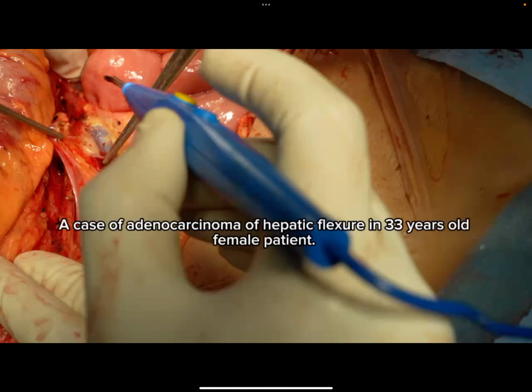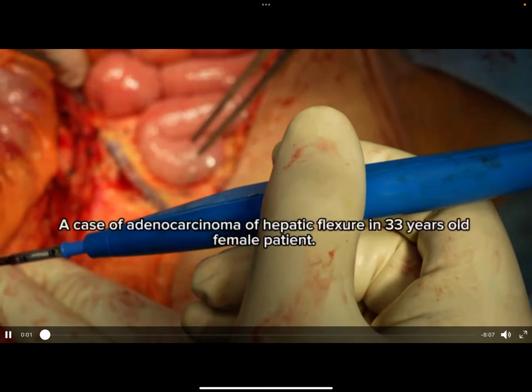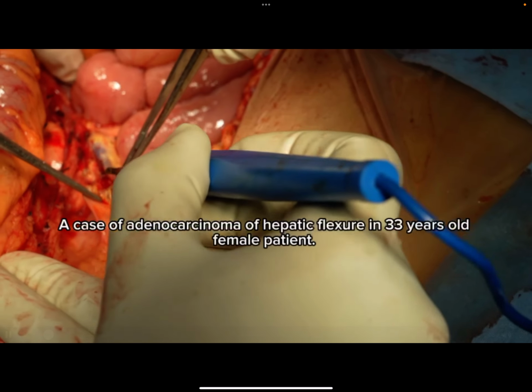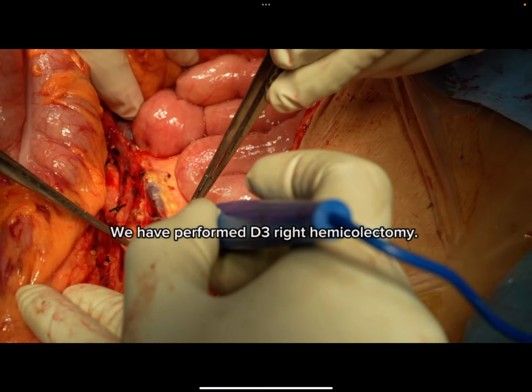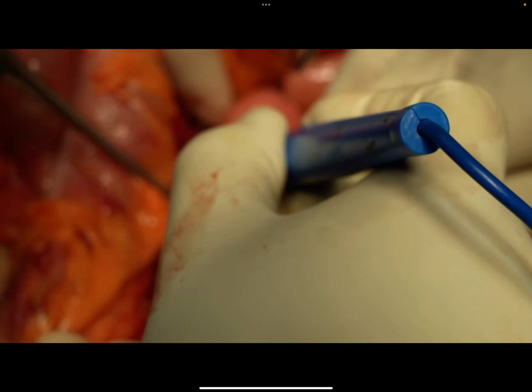So this is a case that was performed yesterday by our team. Just have a few minutes of attention. A case of adenocarcinoma of the hepatic flexure in a 33-year-old female patient. We have performed D3 right hemicolectomy. Here are a few basic steps of the surgery.